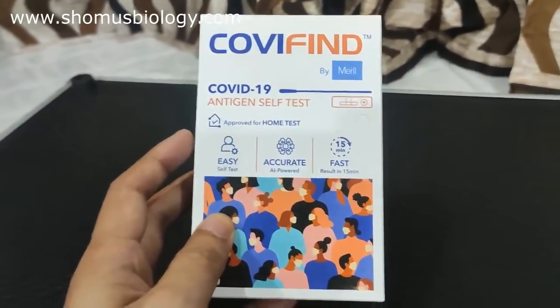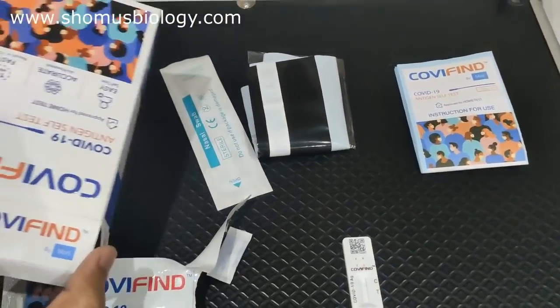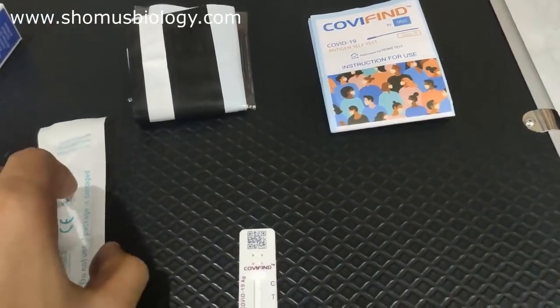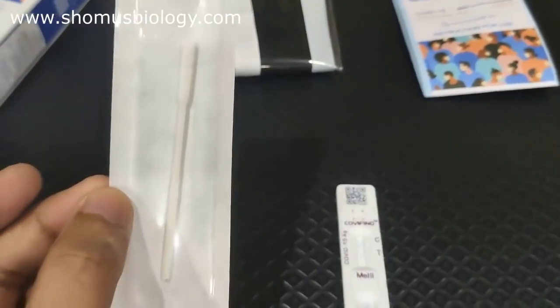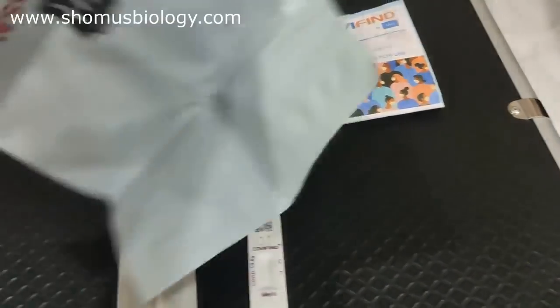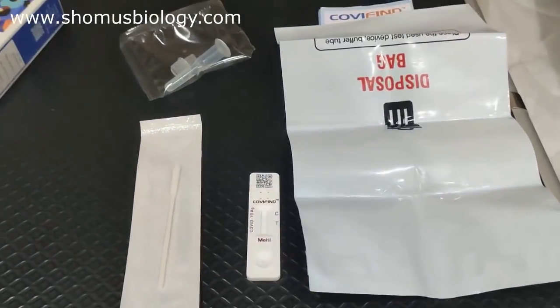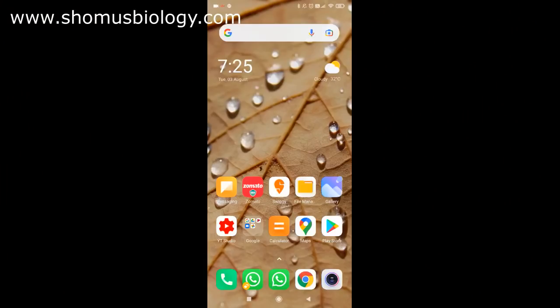Let's download the app and register. Here are the components — I've unpacked them from the box. This is the actual cassette. Remember to scan the QR code on it — that's very important to generate a report. We also have the nasal swab, which is slightly smaller than Coviself's, and a disposal bag that's really big so it can accommodate everything, plus the buffer solution pack.